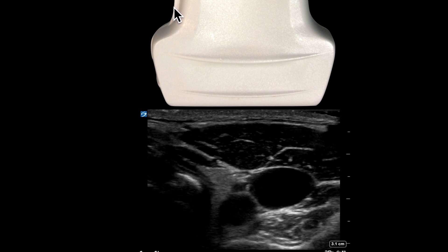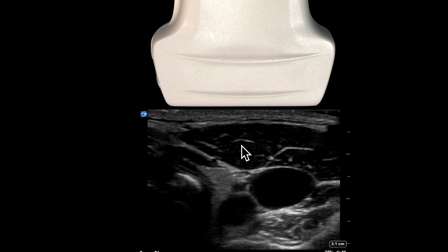You need to focus on where the probe marker is in correlation to the marker on the screen. Here we can see the probe marker and the probe indicator correlating. The key is that if you see your needle tip and know you need to redirect to get access, that movement correlates with what's on your image and the movements you're doing externally on the patient.